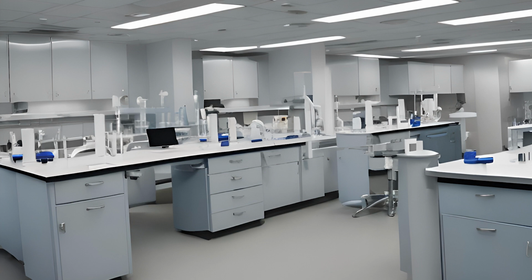And when I say get your gauze pad ready, if you have gauze that's already open in a big, large bulk container of gauze, just grab one, set it where you can reach it with one hand, and you're good to go. If you have individually wrapped sterile gauze, take your gauze, open it, set your sterile wrapping down, and then place the clean gauze on top of that sterile wrapping. You don't have to do sterile technique for this because this is not a sterile procedure. It is a clean procedure.